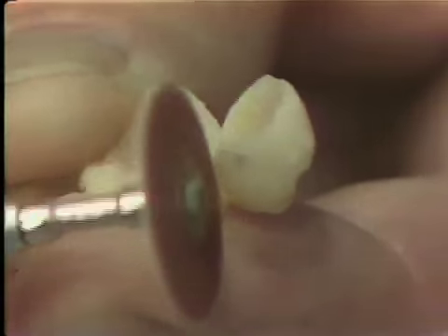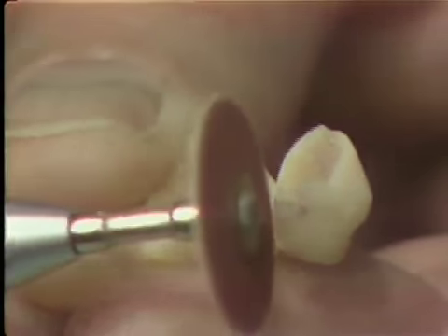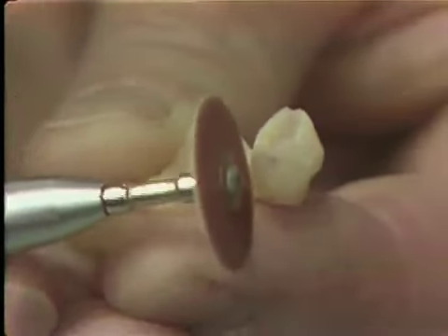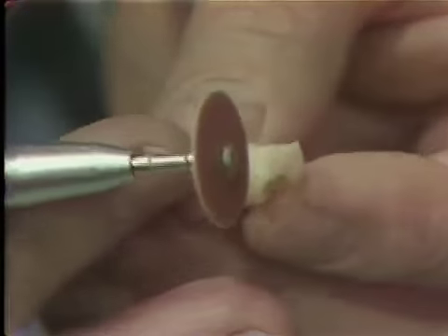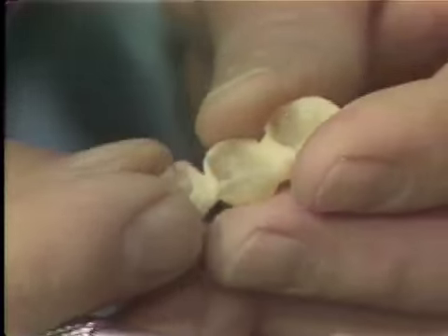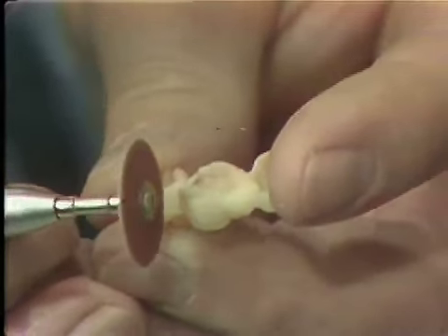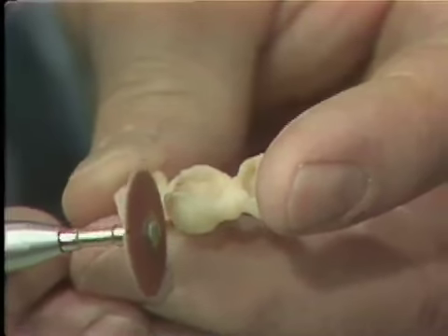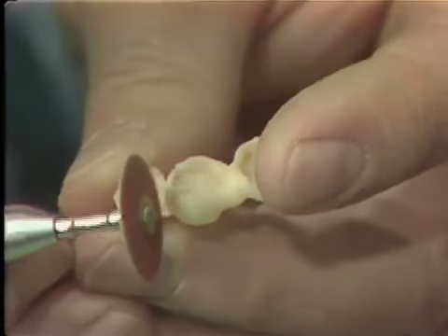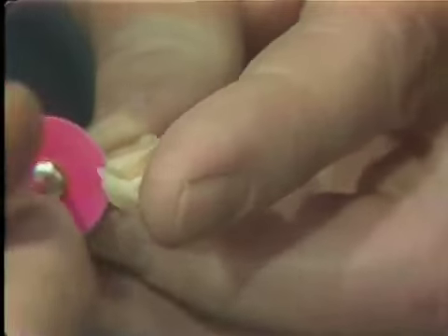Generally, we join the temporaries together because in the later stages, when we have to remove all the temporaries for taking their centric registration, it's much easier to take out 3 temporaries at a time rather than have to take out 3 individual temporaries. The only reason for tying these temporaries together is for convenience in placing and removing the temporaries in the procedure.